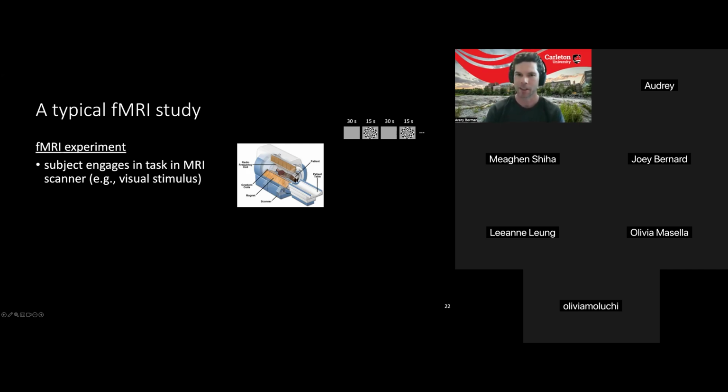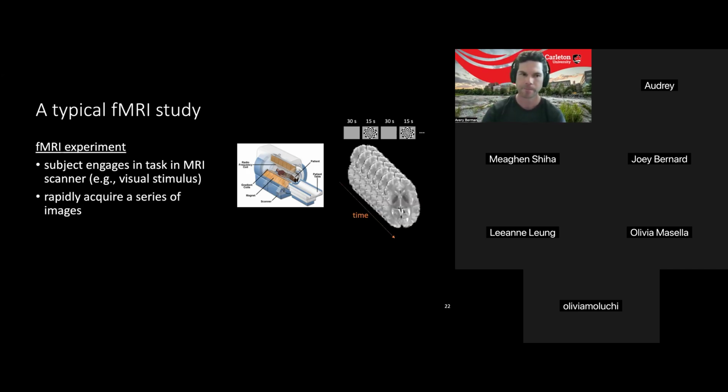And then for 15 seconds, we'll be looking at this radial checkerboard pattern, and it's going to alternate. The black and white blocks are going to alternate at 8 hertz between first white, then black. And this really stimulates the visual parts of our brain. Then it turns off after 15 seconds, and we'll repeat this over and over and see what areas of the brain are activating.